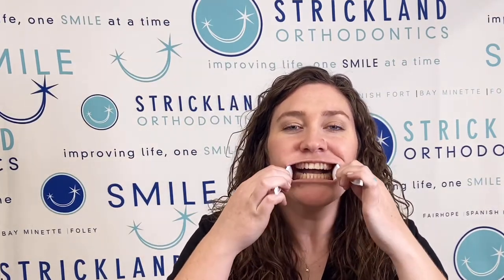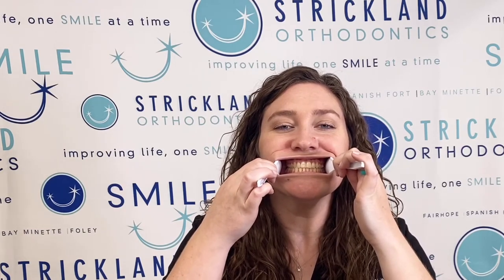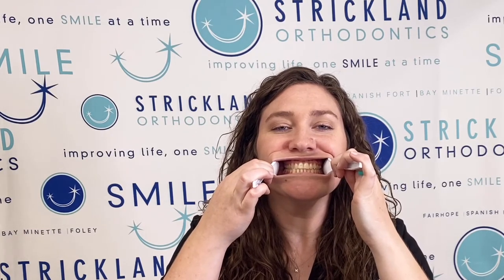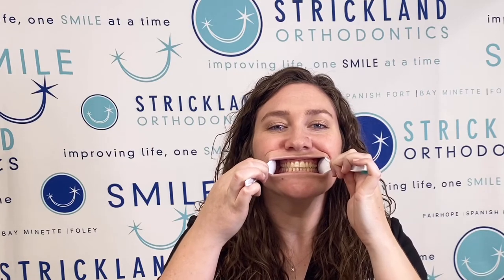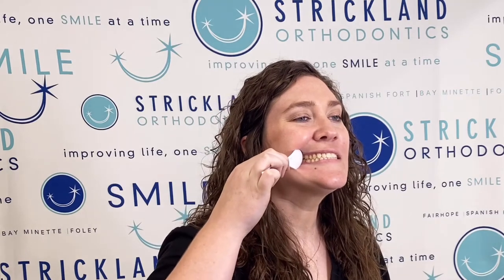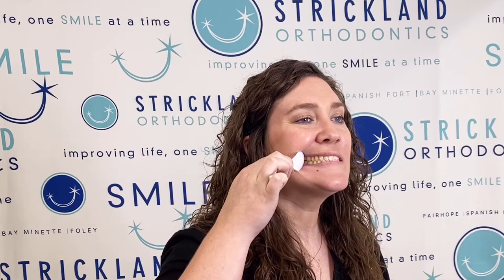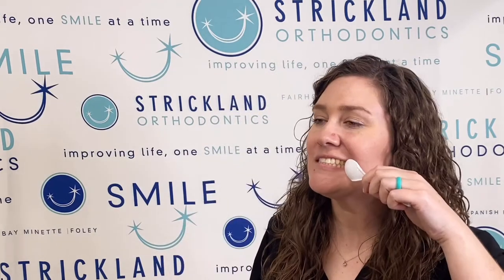We'll go ahead and have a front of the teeth. You can use some spoons to help pull your cheeks out — slide them in and get a picture of you biting down all the way on your back teeth. Then we'll get one of each side. Slide the spoon in and make sure you try to pull the corner of your cheek back as far as you can so we can actually see the sides of your teeth. Then do the same thing on the other side.